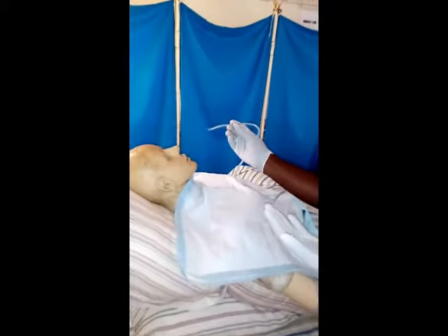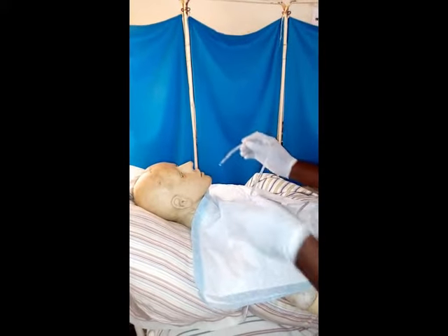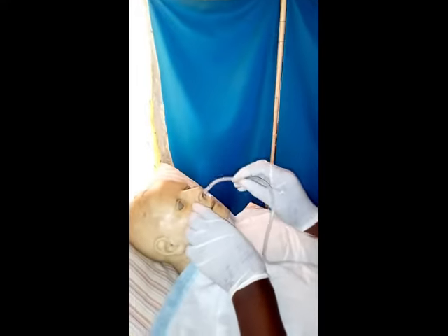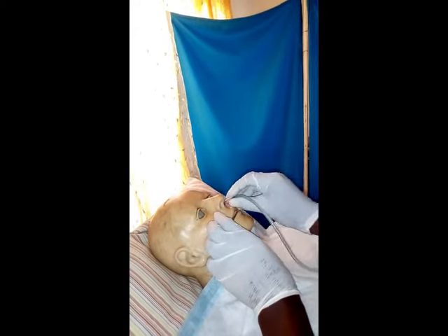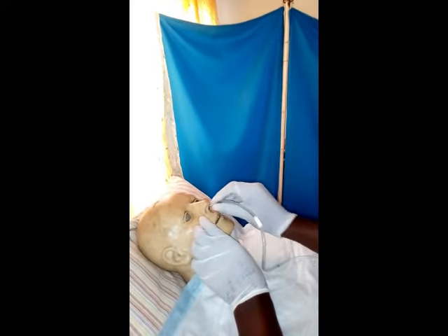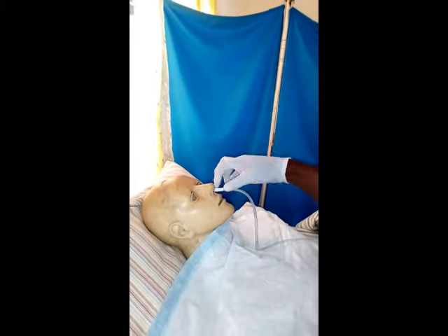Okay, so Mrs. Mape, you should be swallowing. You need to instruct Mrs. Mape to be swallowing as you push in the tube. Okay, Mrs. Mape, I've started. You need to swallow. Swallow. She has swallowed. As she's swallowing, I'm pushing. Swallow, just like that, and I'm pushing. Swallow, and then you have to be fast, okay? Then as you reach the mark, you stop there. So that's the end part. That's the use of this mark.